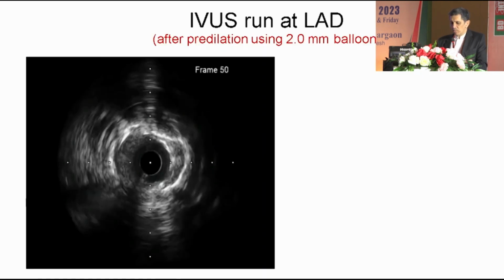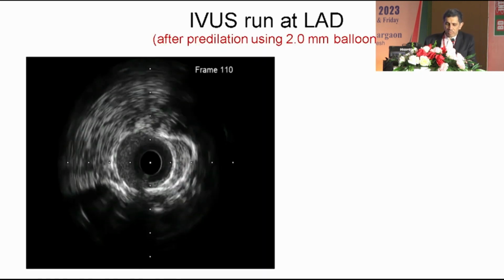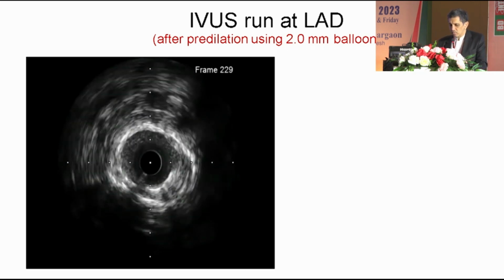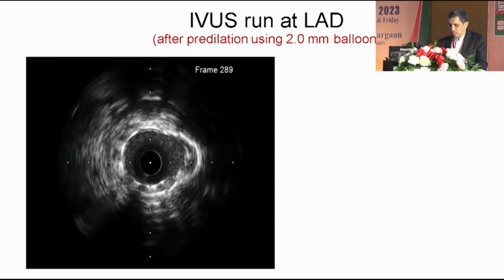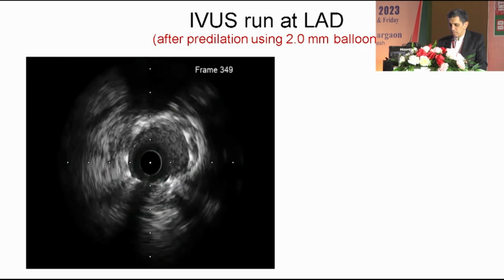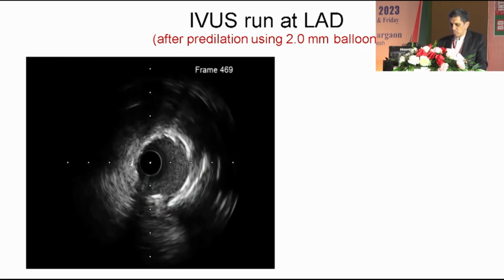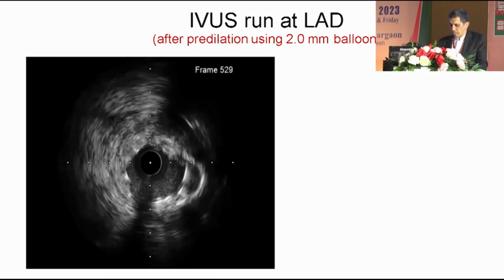At the time, we did IVUS after pre-dilatation to the LAD. You can appreciate here the proximal LAD segment, and then coming to the left main.